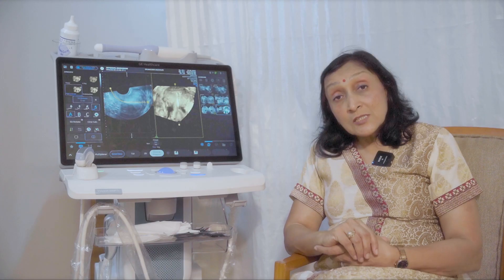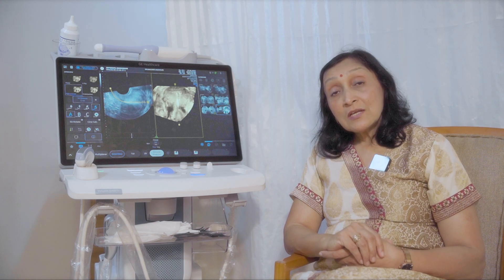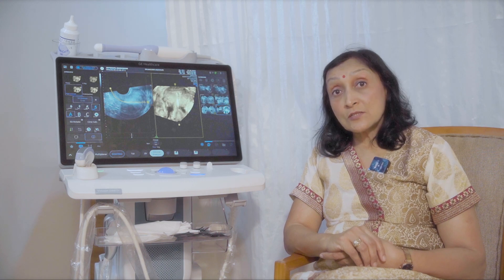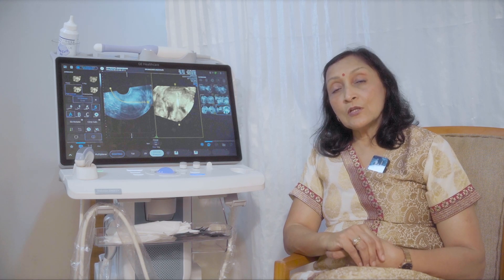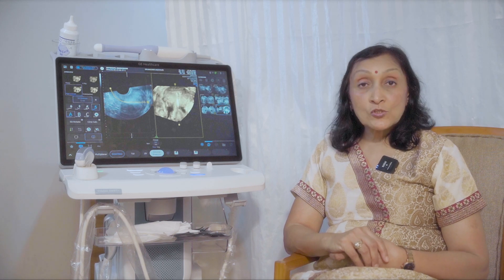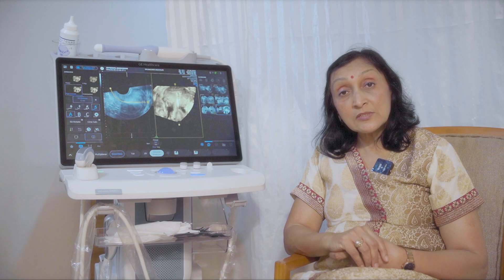In spite of being such a handy machine, it still has a very good quality Doppler. You can pick up all the flows of the follicle and of the endometrium — just like you can pick it up on any good Voluson. The 2D image quality is also very brilliant.